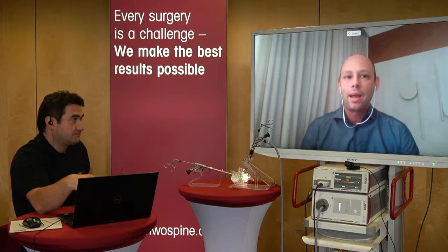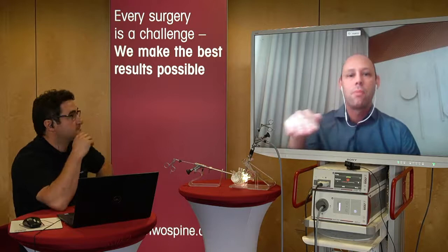With the stenosis endoscope, we are able to do the surgery a little bit faster, to drill the facet joint and the bone and the lamina. But I think it's not so good to go over the top and resect bone over the top, because the endoscope is 1 millimeter bigger than the interlaminar endoscope. We can do the surgery a little bit easier with the interlaminar endoscope.